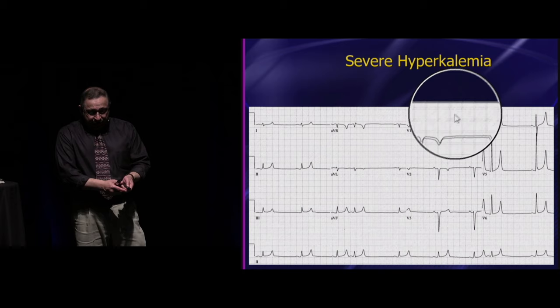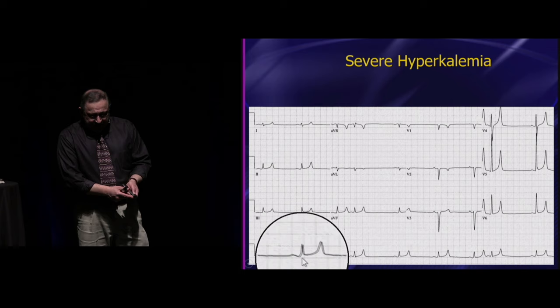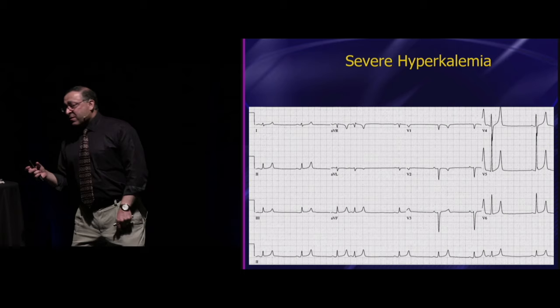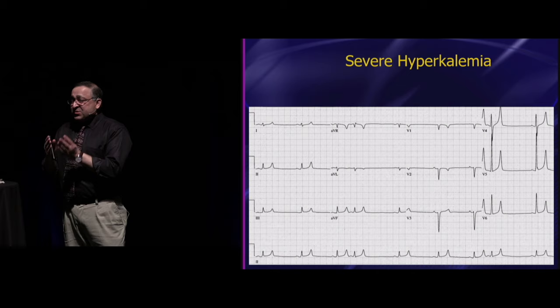They're looking at this and saying, there's a P wave there, and then is this Mobitz 1 or Mobitz 2? Forget it. Don't think so much about it. It's bizarre. And that's another pearl. Anytime you look at a rhythm or an EKG and the first word that pops into your head is the word bizarre, bizarre in emergency medicine equals hyper-K.